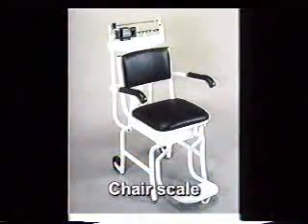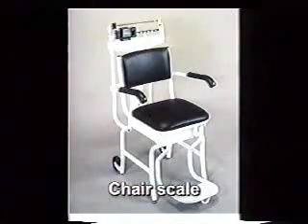Another type of scale is called a chair scale. A chair scale is used for patients who cannot stand independently on an upright scale. This might be a chair that they come and sit down on, or it might be a platform that a wheelchair is just pushed onto, but they nonetheless stay in a seated position. This chair scale does not have the ability to measure the person's height, only the weight.